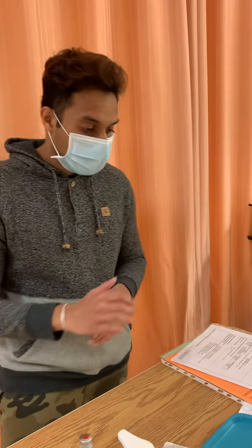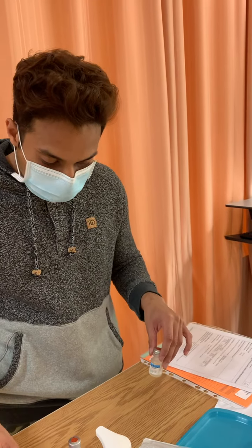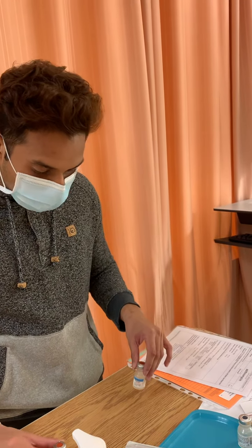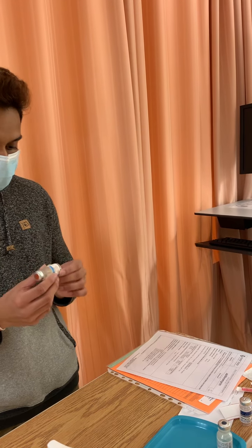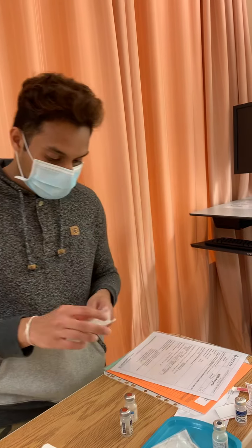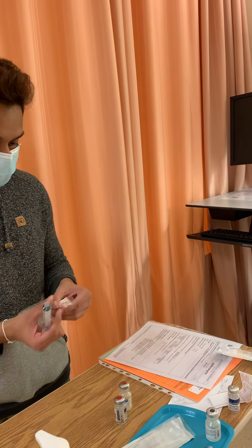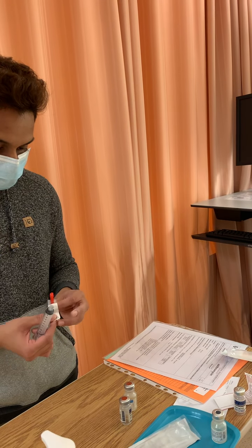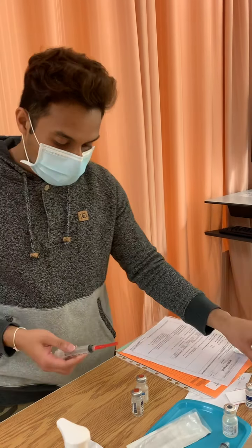Okay. So now we're just going to wash our hands and grab our sterile water. We have our sterile water here, and it's a new bottle. It's intact and not expired, so it's good. We're grabbing our syringe as well. It's a 10 ml syringe. And we're grabbing our blunt fill needle. Okay, so we're now going to aseptically attach that.